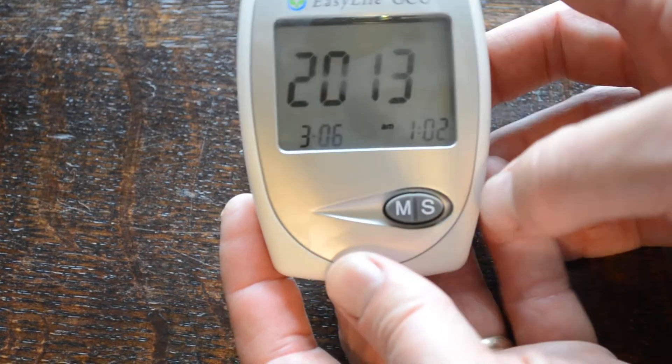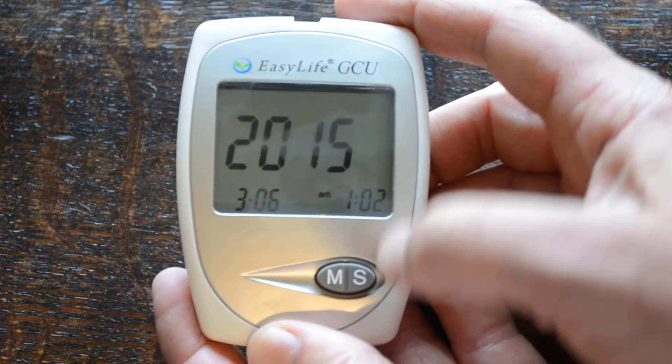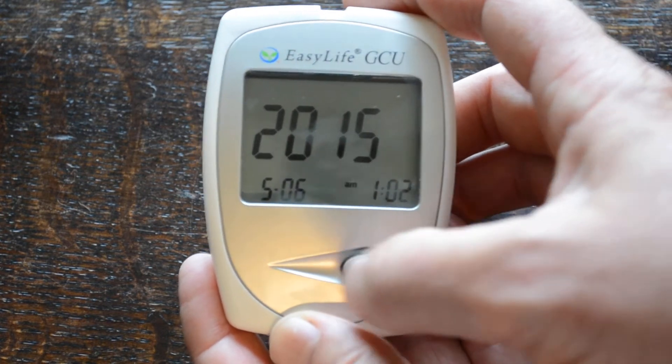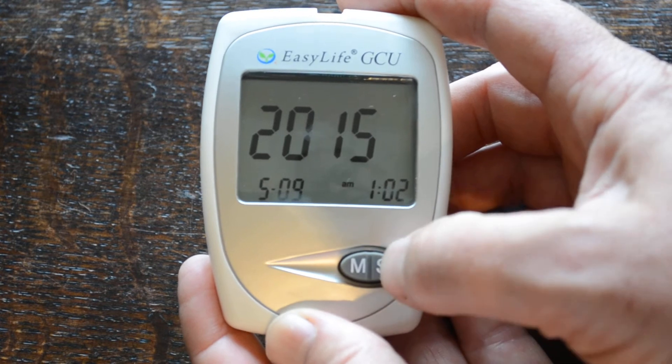If you apply the battery compartment you'll see it's flashing with the date initially. Press the S button to navigate to the right year. Press the M button to navigate to the next function, which is month — 3, 4, 5 for May. Then press M again for the date, which is the 11th.